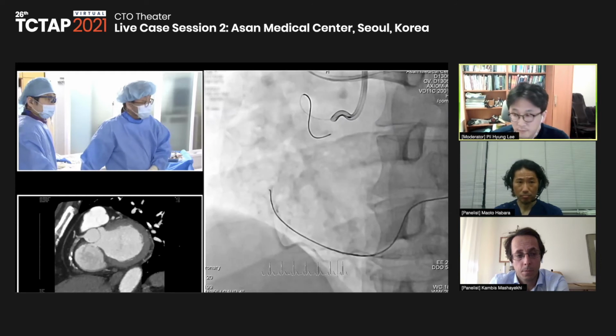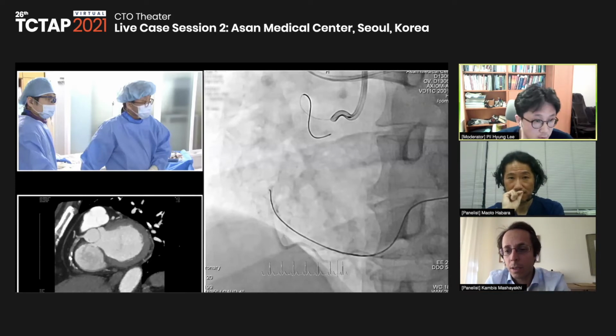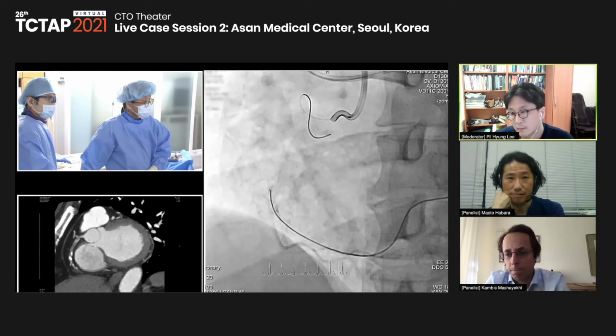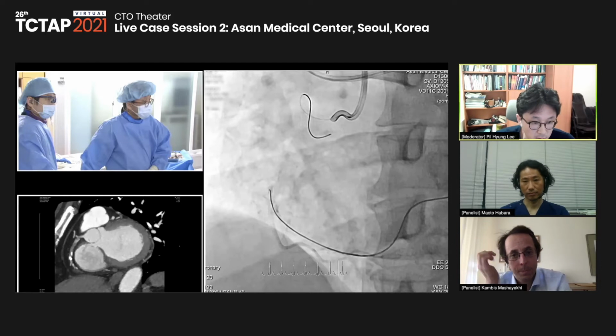So I think I have to explain why I chose the epicardial collateral rather than the septal. In general, the question is, why did you change strategy here so early? Oh, maybe I missed the point. For the retro, you mean, right? Yeah. So why didn't you first try to prepare antegrade CAP? Yeah, actually, the wire could not go in the point exactly where I wanted. So my strategy was that if I could just go in with the retrograde, I just wanted to keep my wire in the true lumen and go for the retrograde wiring.